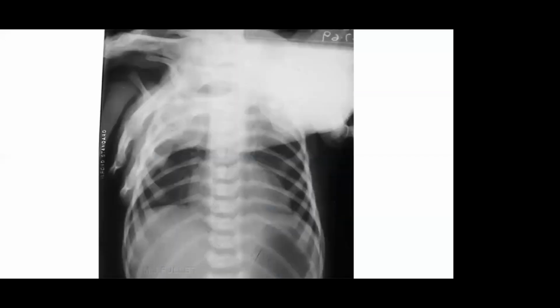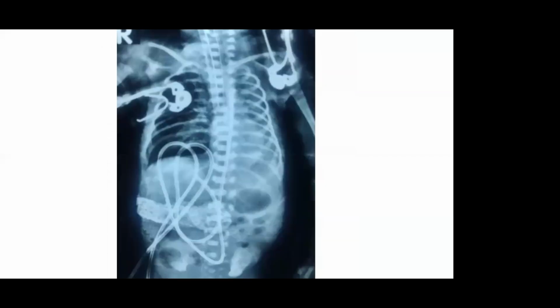So you should not take an X-ray like this. Try to identify the lines, try to take care of the lines, and accordingly take an X-ray so that they are not obscuring your area of interest. Whenever you are restraining the baby, see to it that you are not getting X-rayed, but the baby is. So your hand should not be obscuring the area of your interest.